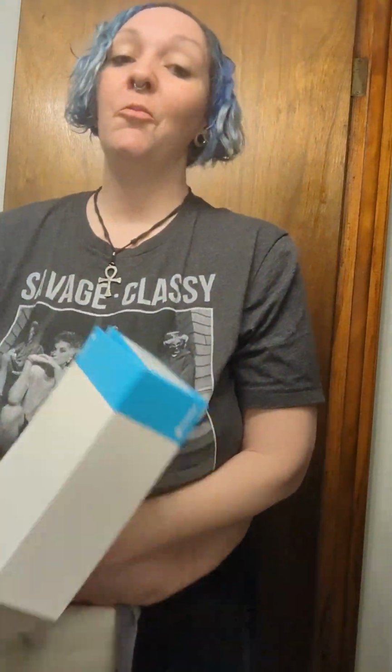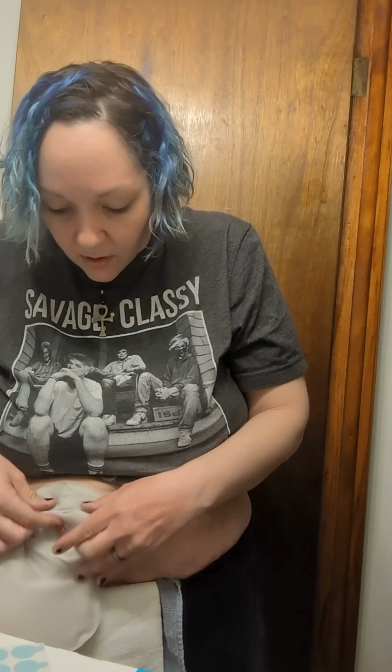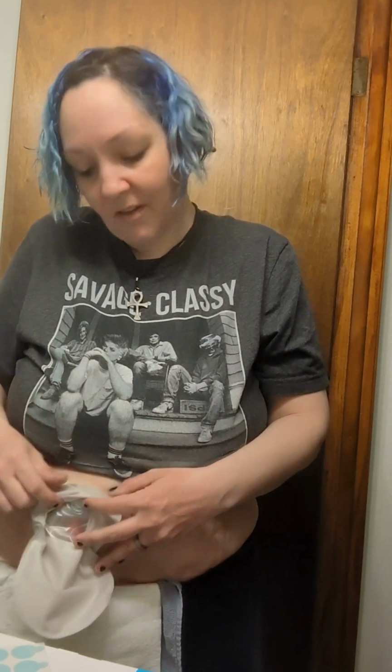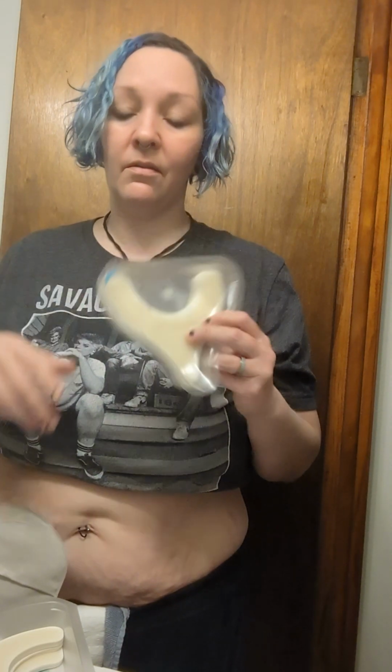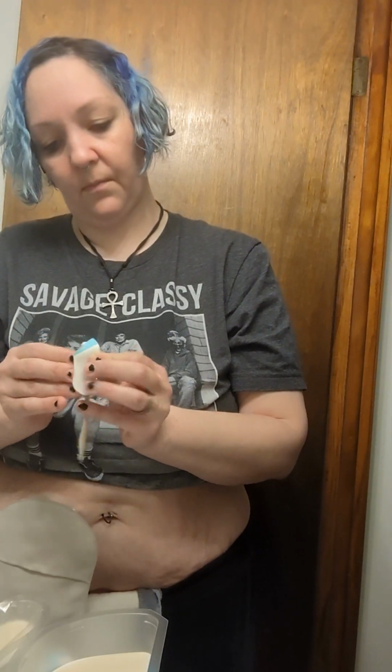The one thing I wanted to point out about Coloplast that I really appreciate in their boxes, they give you filter stickers. You put that over the filter if you're going to take a shower, a bath, or go swimming. It helps maintain the integrity of the filter. In this area right here, there's a filter that allows gas out. There's a window that allows me to see my stoma. And the last thing I do is I take my rainbows and my Ys. Gotta always have a question, right? And these help protect me even more. So I'm going to show you this part and we are done.